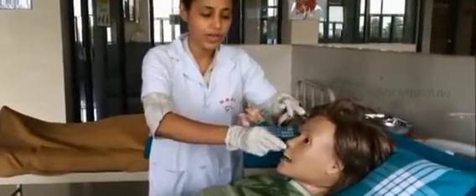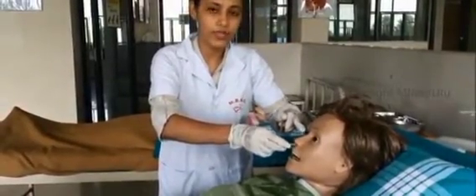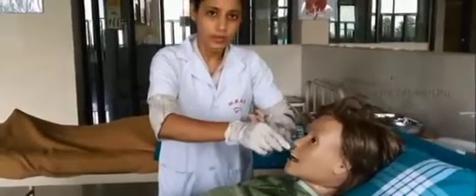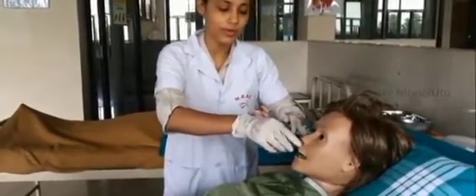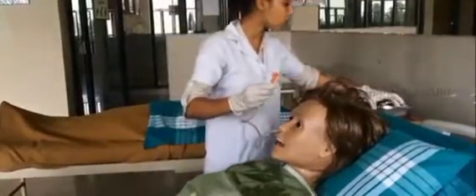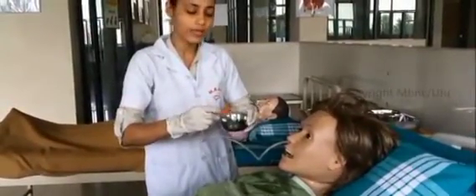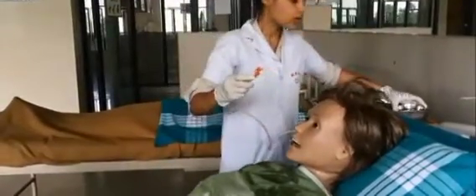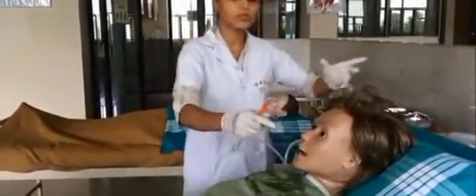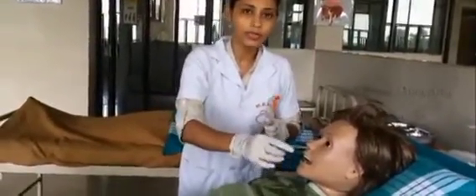During insertion, if the patient has restlessness or breathing difficulty while we are inserting, there is a chance the placement is not in the stomach, maybe it is in the respiratory system. If the patient has more gag reflex and restlessness, immediately we have to check at the base of the tube. We take a bowl with water and keep the end of that tube into the bowl, and if continuous bubbles are there, it shows that the NG tube is in the respiratory system. So immediately we have to remove it, clean it, and then insert the NG tube again.